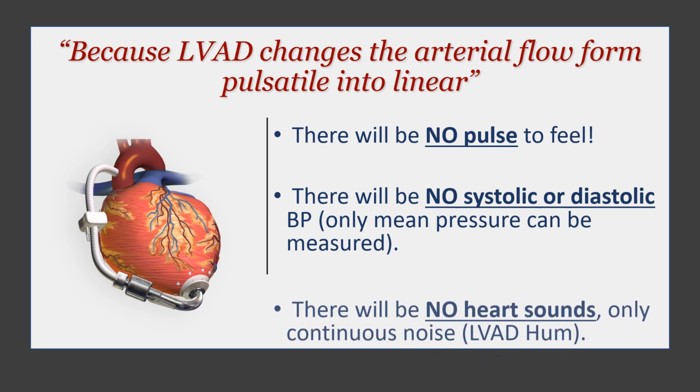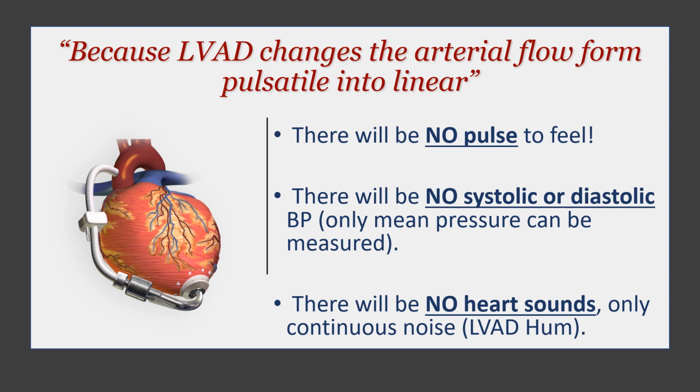And lastly, if you try to listen to the heart sounds, you will hear nothing other than what we call the LVAD hum. It's basically just a continuous noise coming from that machine. Sometimes they say it's very similar to a dishwasher noise, and when you listen to it for the first time, this is exactly what you're going to feel you're hearing. It is just like a continuous noise of a dishwasher.